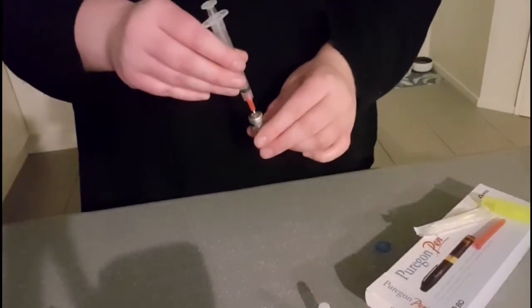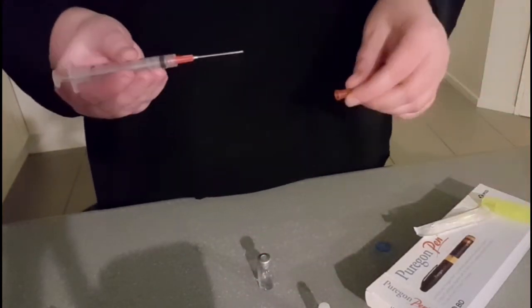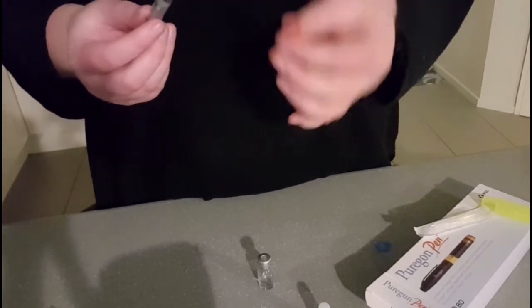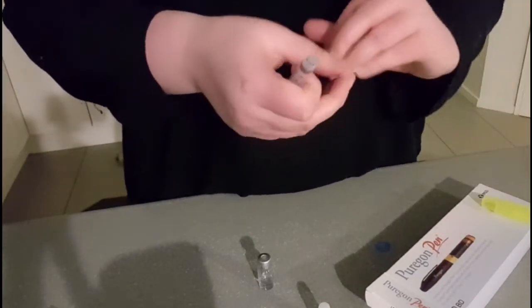Oh gosh, a lot's going on. Now take this out, place your solution here, put the red cap back on, and you can discard this red one into a sharps bin. Right, we're getting there. Now the yellow one.